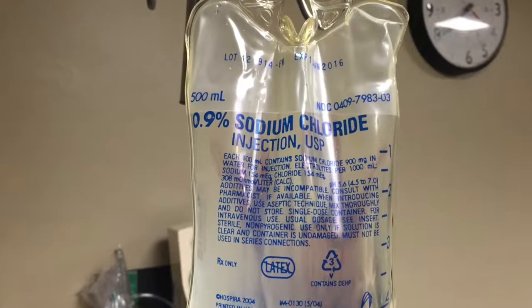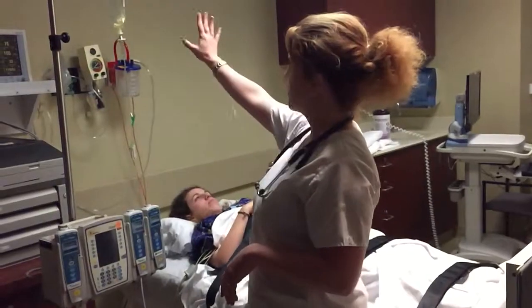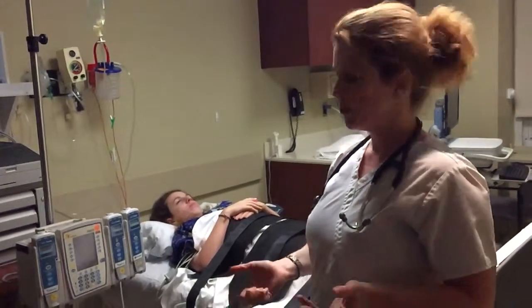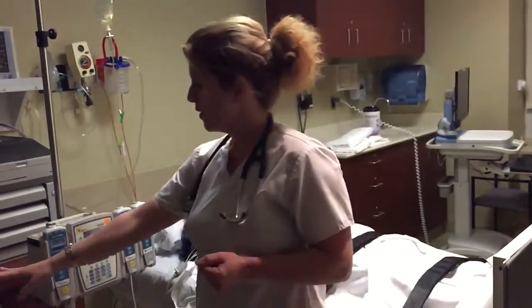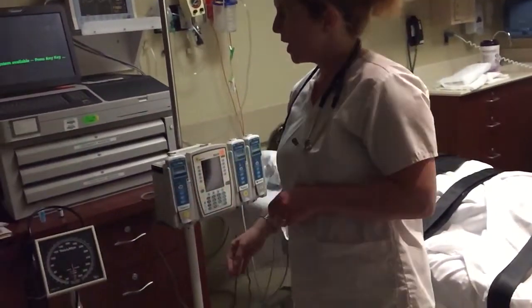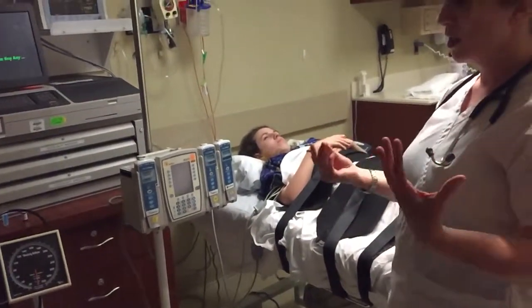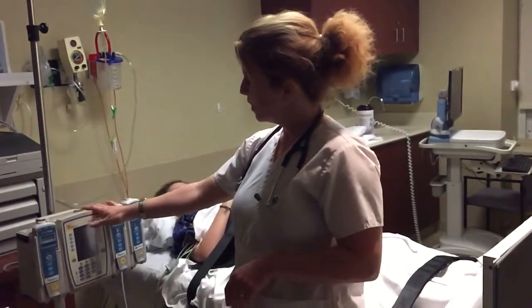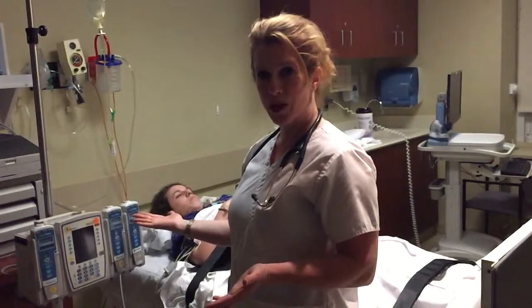We start an IV in their arm, as we might need this 0.9 normal saline later for blood pressure and/or to give medications. Another thing that we have on hand is an old-fashioned blood pressure cuff, just in case the monitor is cycling and we need to get a really fast or stat blood pressure. We have an IV pump here in case we need to give IV meds later on as well.